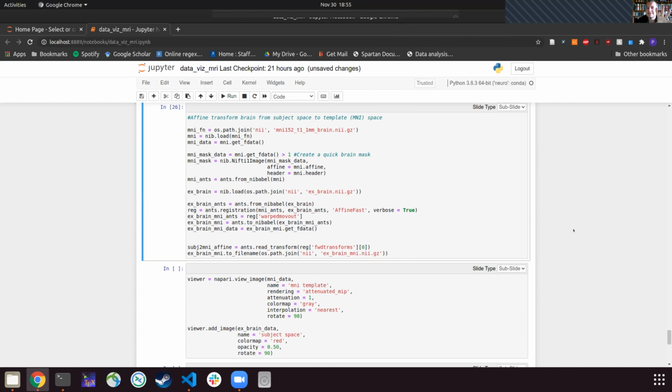Running this, I would just like to very quickly say the reason that this is going on so fast is because I'm just using what is called a simple affine transform. Now, affine is the second lowest form of quality that you can get when smushing brains together.